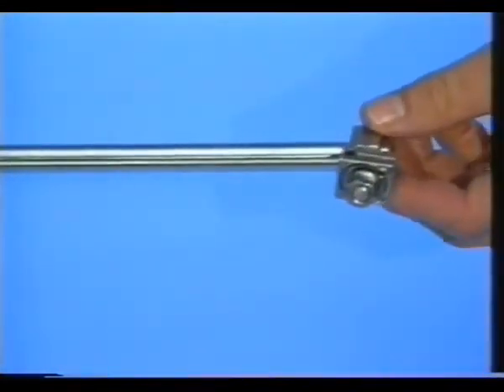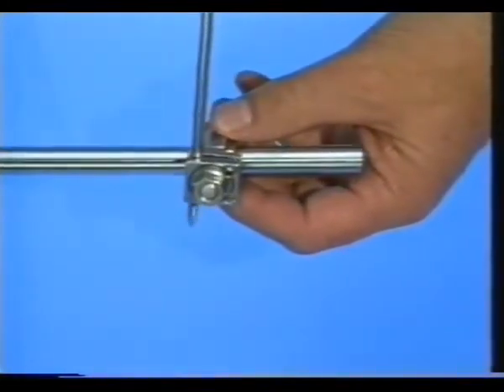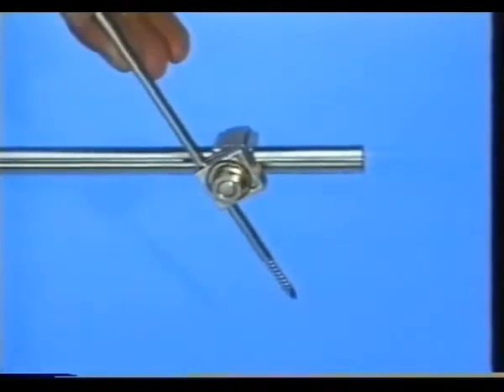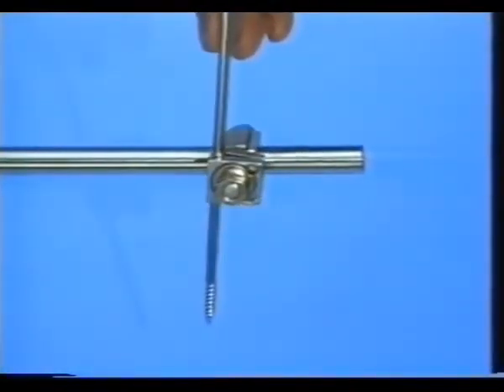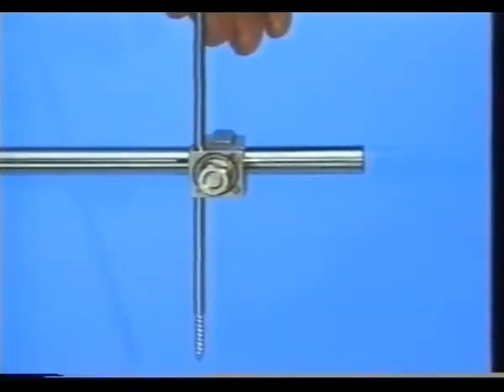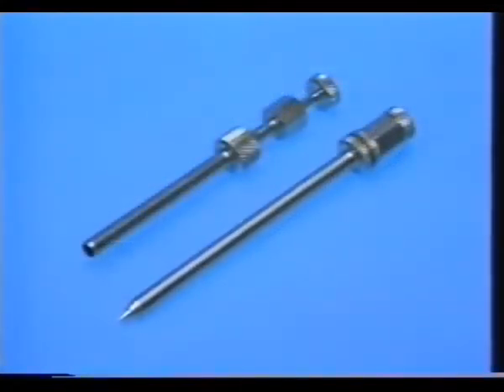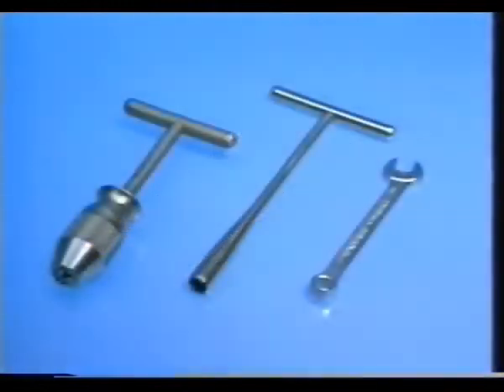The single adjustable clamp fixed on the tube allows free placement of the Schantz screw. The instruments you need are a small air drill and long drill bits, 4.5 and 3.5 millimeters. The triple assembly of Trokar in two drill sleeves in a long and short version. A universal chuck with T-handle, a socket wrench, or a combination wrench.